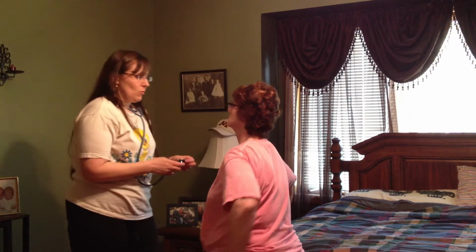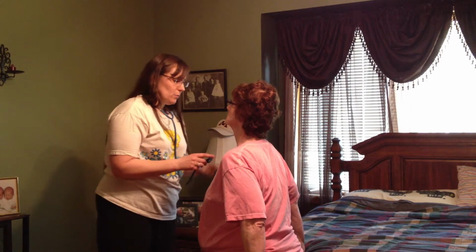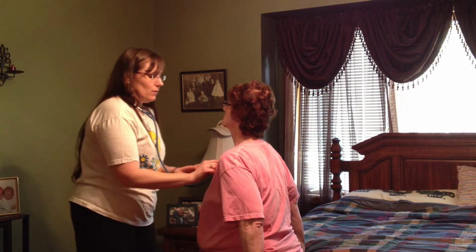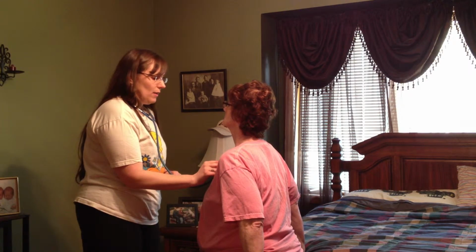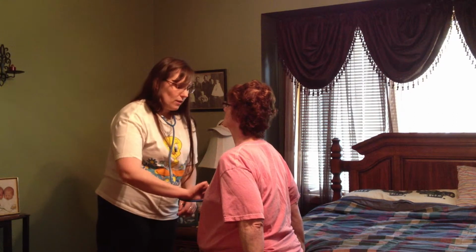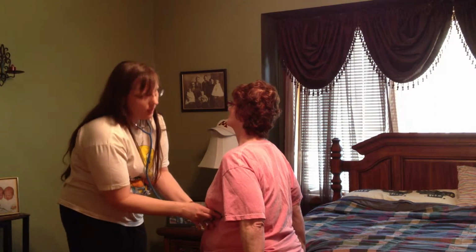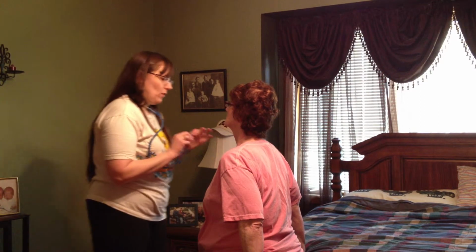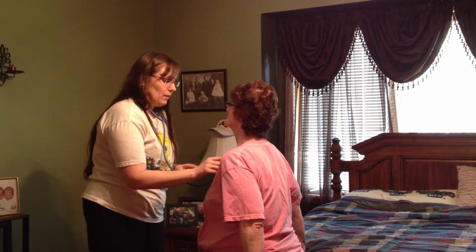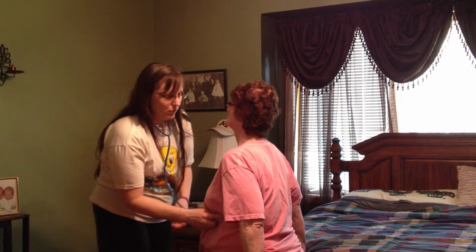Okay, and then I'm going to listen for the 5 heart sounds. Second intercostal space on the right-hand side is the aortic, and second intercostal space on the left is the pulmonic. Third on the left side would be Erb's point. Fourth would be tricuspid. Fifth would be mitral valve underneath the breast, and that would be at the apex of the heart. And then I'd listen with the bell of the stethoscope, aortic, pulmonic, Erb's point, tricuspid, and mitral valve.